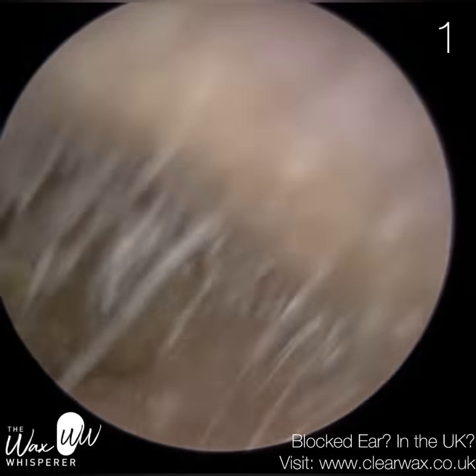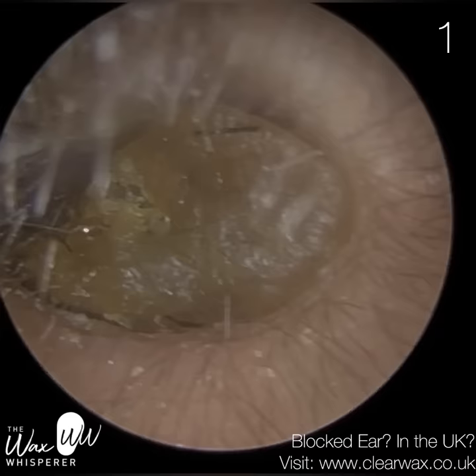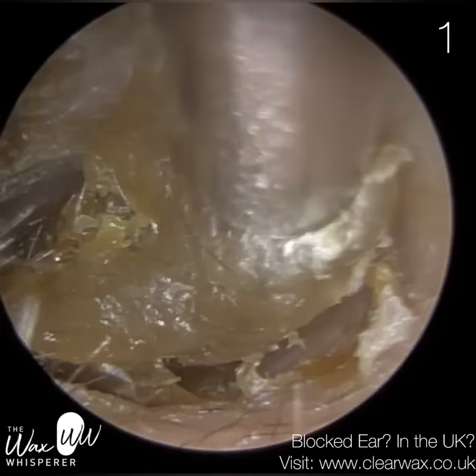Hi everyone, this is Neil Reiteter, also known as The Wax Whisperer. Thank you for joining me in my latest video. I've decided to group together 11 different earwax removal procedures in one video for you guys.